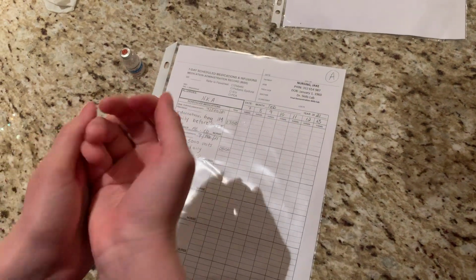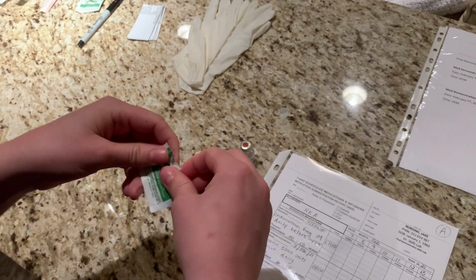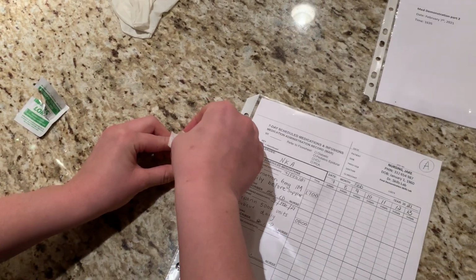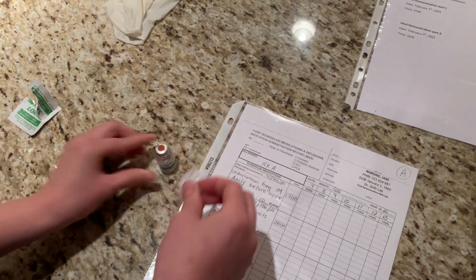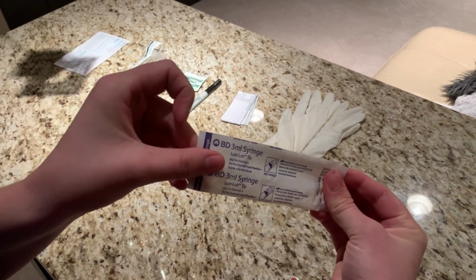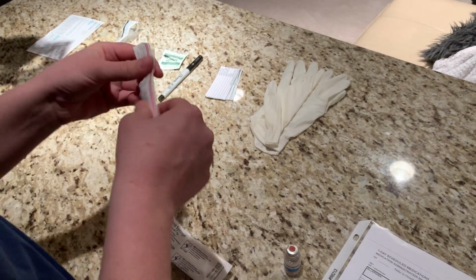So I'll do hand hygiene again, pull an alcohol swab, and I'll clean the top for 30 seconds in a circular motion, and I'm going to let it dry. While I'm letting it dry, I can pull out my syringe. I've chosen a 3 milliliter syringe, as well as a needle.